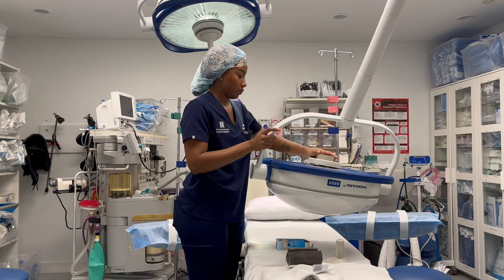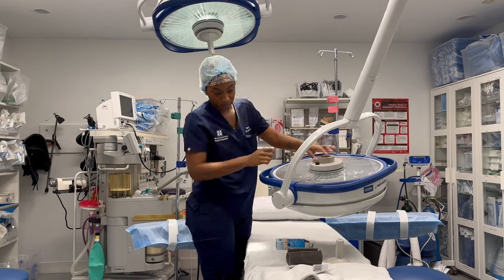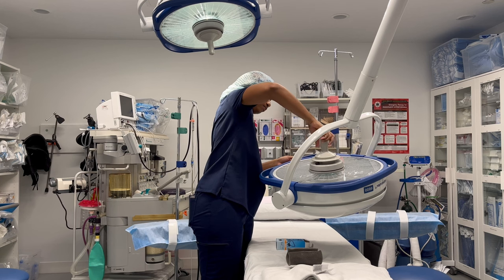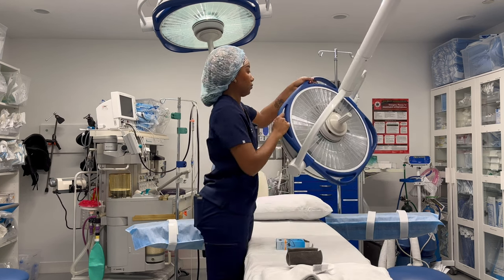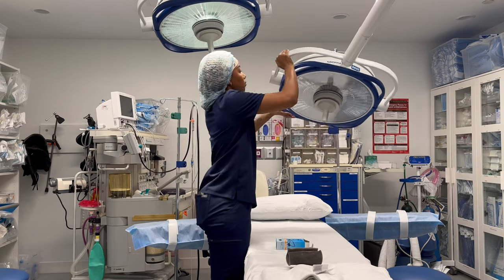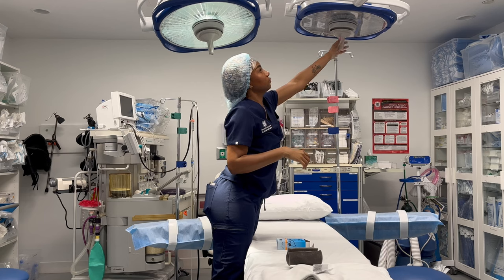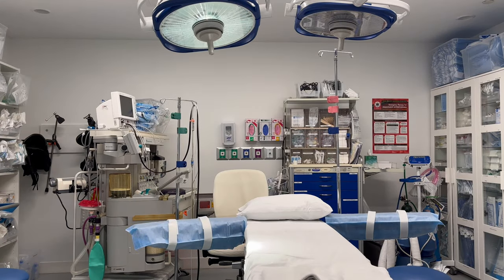It's super simple. The only thing is I didn't know where the bulbs were, so I had to go ask my nurse, but the whole exchange was pretty simple. Then I put that back, and I test the lights to make sure I actually put it in correctly and it works. So I did that, and it took a second to come on. I was scared. I was like, oh my God, I did something wrong. But then eventually it came on.